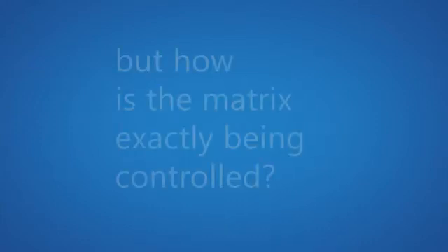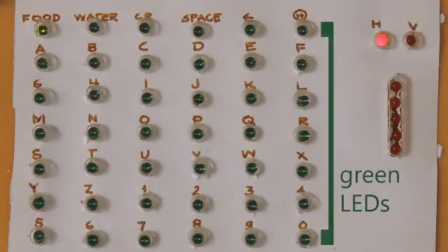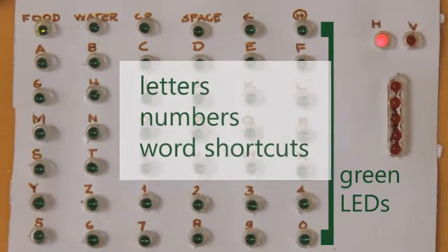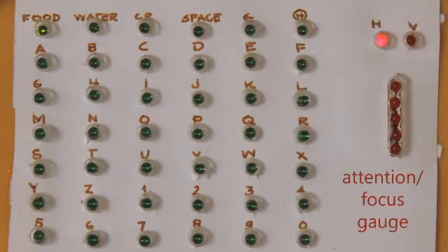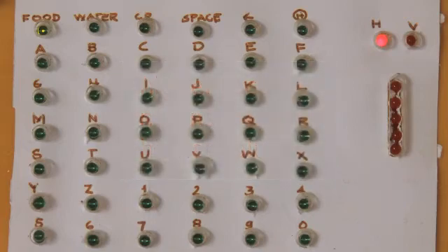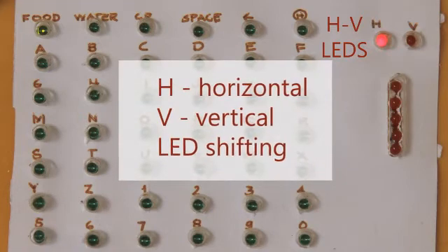But how is the matrix exactly being controlled? The matrix display has three sections. The first section consists of the green LEDs that represent the letters, numbers, and word shortcuts such as space, backspace, etc. The second section is the attention or focus gauge, which measures the amount of focus signal sent by the user — the higher the focusing, the higher the value. The last part is the HV LEDs, short for the horizontal and vertical LED shifting indicators.